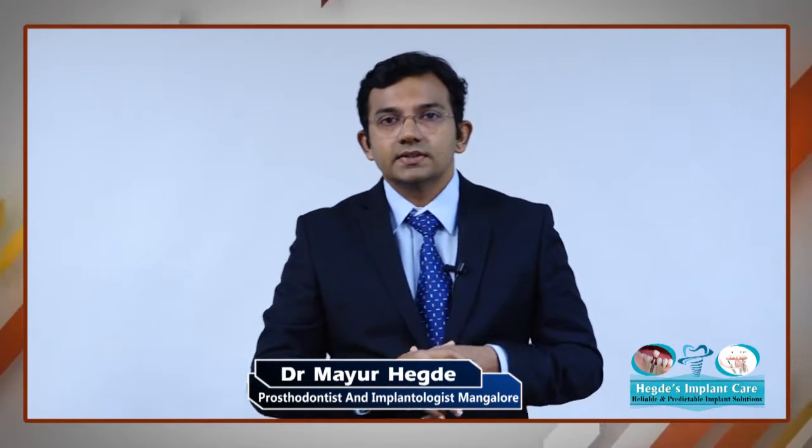So the entire procedure, I would say, is in 3 steps. The first is the placement, the second would be after 2 to 3 months where I have to open it up and make an impression. In about another 4 to 5 days or a week, we can give the crown. So this is the entire duration of the treatment as far as a single implant is concerned.